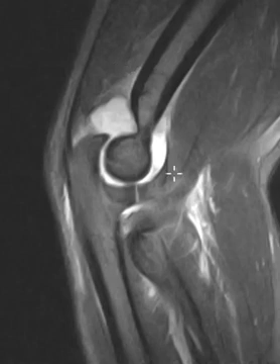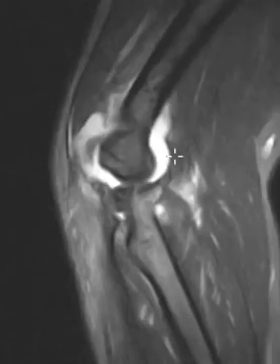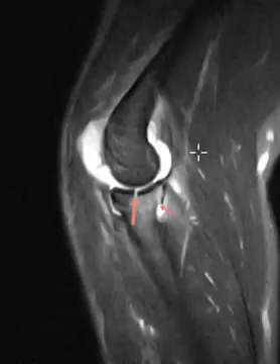Big joint effusion. The elbow here — this is the ulna, this is the radius, this is the humerus — and all this white is a big collection of fluid, a large hemarthrosis. And now if we go to this view we see a couple things.